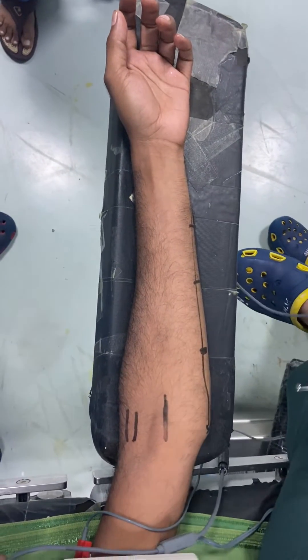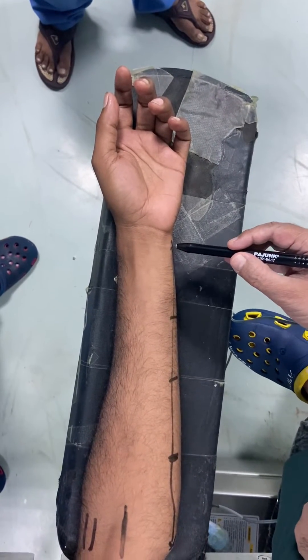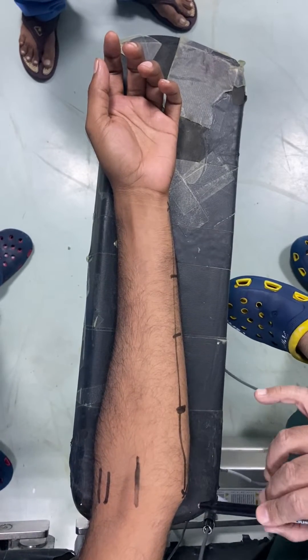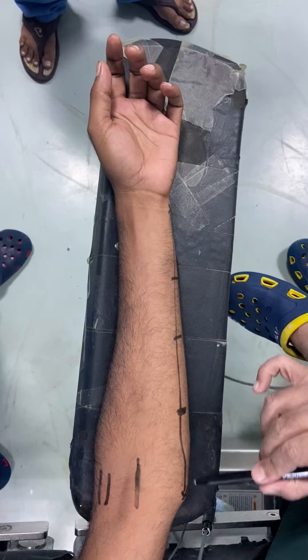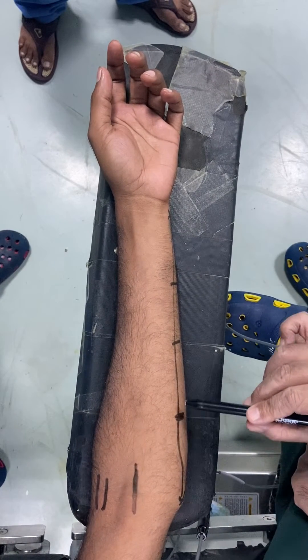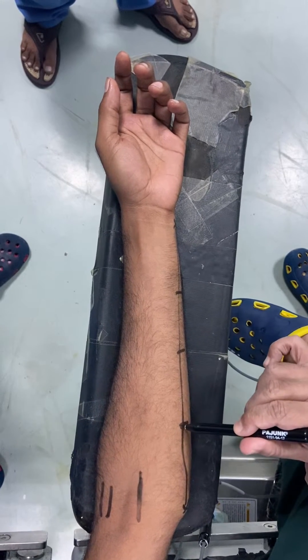After the median nerve block, we will go for the ulnar nerve. For the ulnar nerve, I'll mark the ulnar styloid, then the medial part of the humerus and draw a line. Then I will divide into the proximal one-fourth and distal three-fourths, and at that junction I'll put the needle.